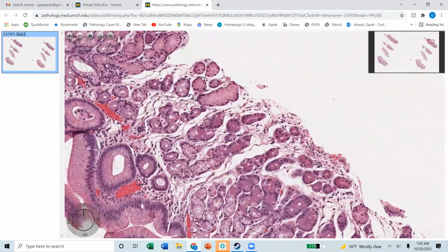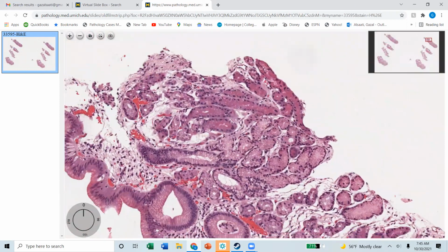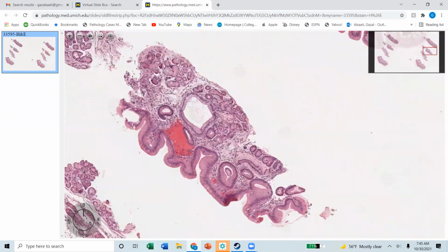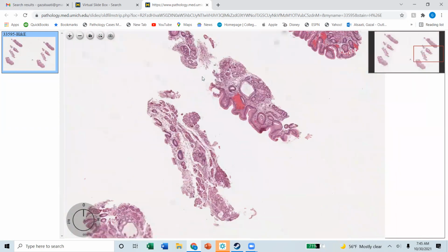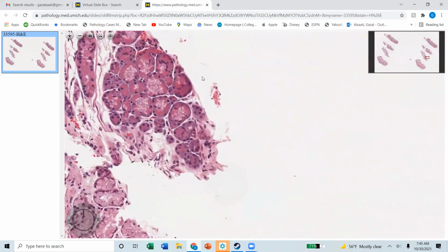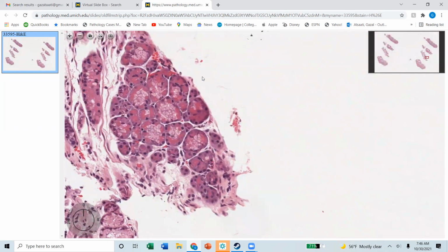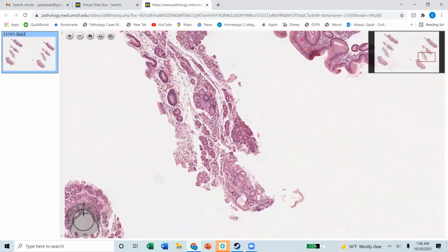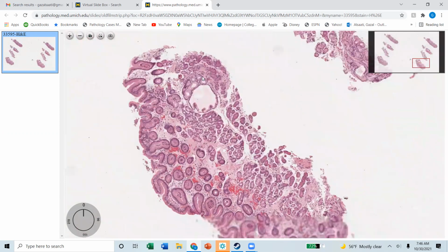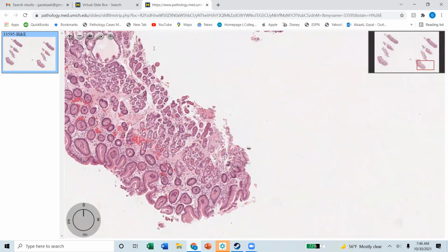Lots of pancreatic acinar cells. The one we saw with the AMAG was a much better example. Okay, here it is. A small piece of pancreas laying down inside of your stomach. When you see it, you have to make sure you're not dealing with AMAG.